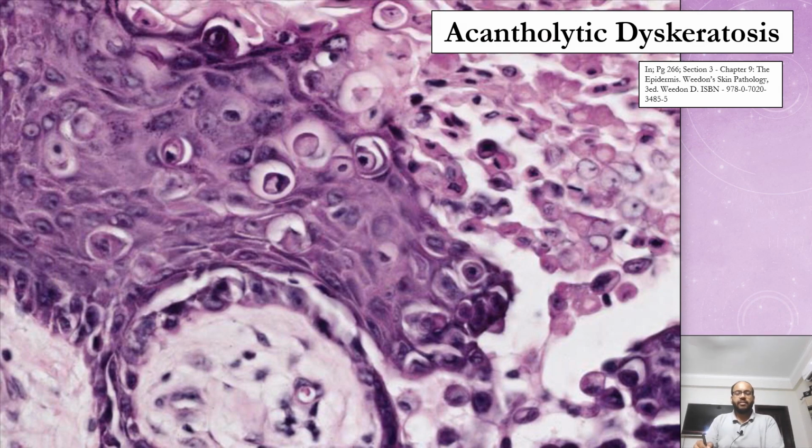So here is a magnified image of acantholytic dyskeratosis so that you can see the corps ronds here. So this is a corps rond, this large cell. You have a thickened nucleus, a halo around it, and the cell doesn't look normal. In the prior slides, we have discussed the normal appearance of epidermal layers, but here the cells do not look normal. They look out of place. And they are present at the level of stratum spinosum and stratum granulosum, isn't it? So these are known as corps ronds.